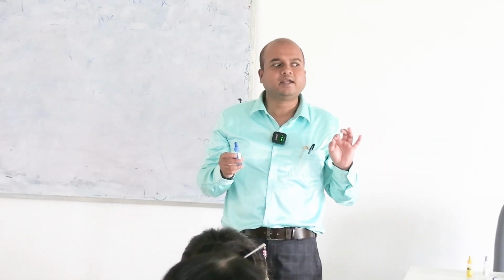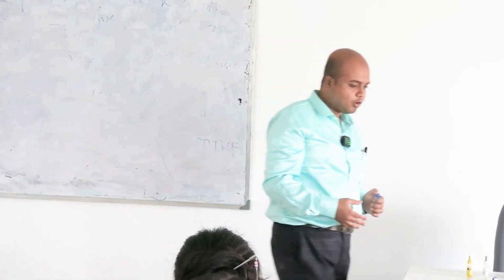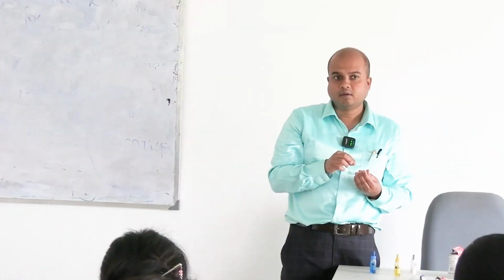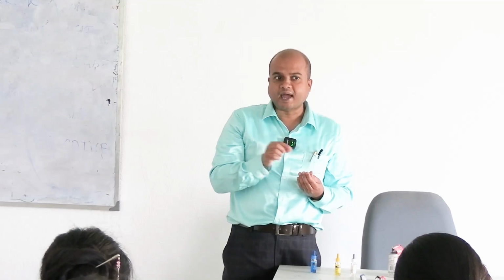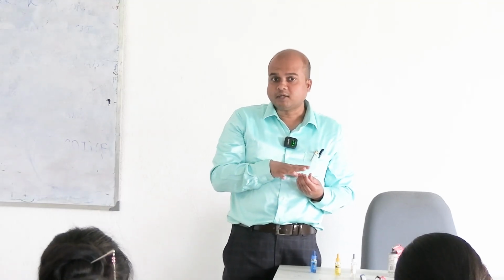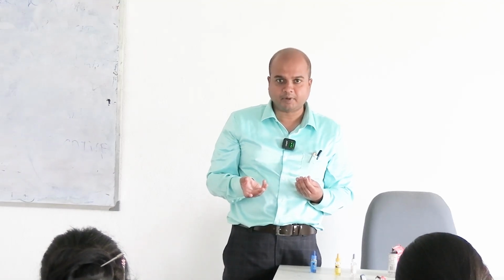If it is not clear to the naked eye, we see it under the microscope. You can obviously understand that the blood and the different types of antisera must not get mixed, otherwise the results can't be obtained.